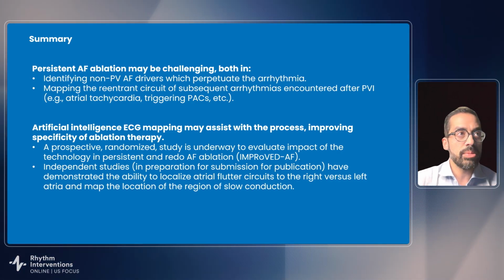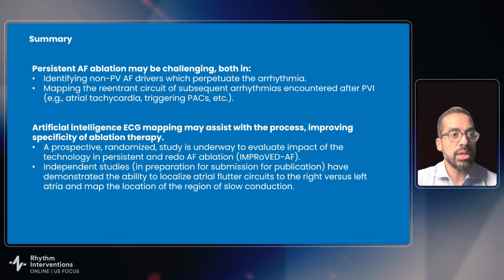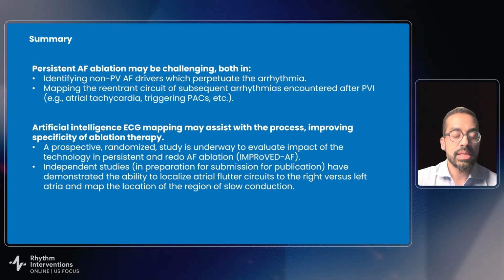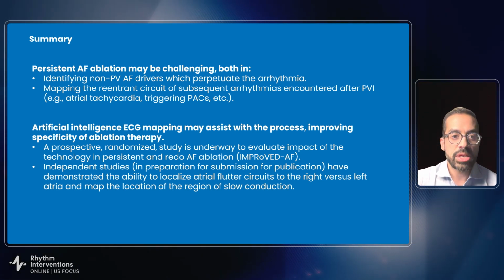And Saumil described how in his patient, the VMAP was being done during the case. And I think that's a point that should be emphasized, that multiple ECGs can be analyzed throughout the case in rapid succession.